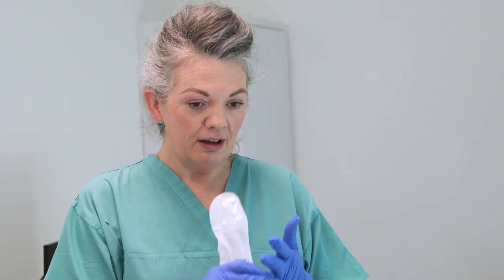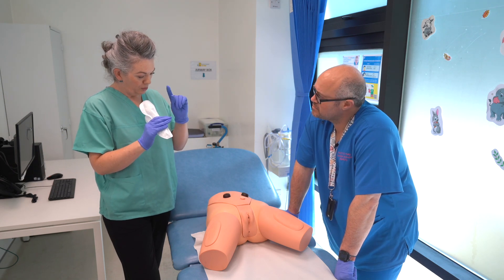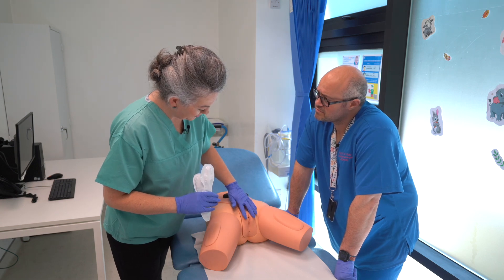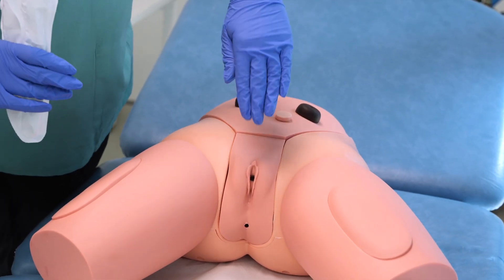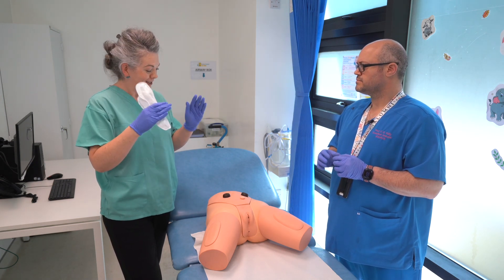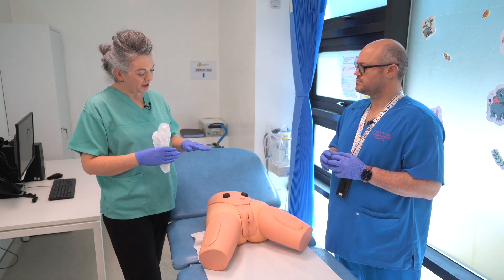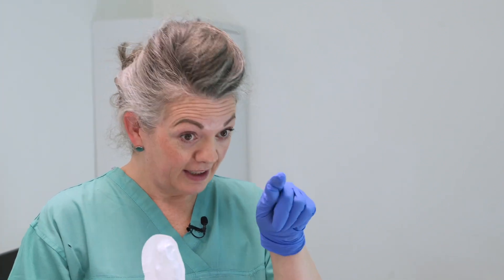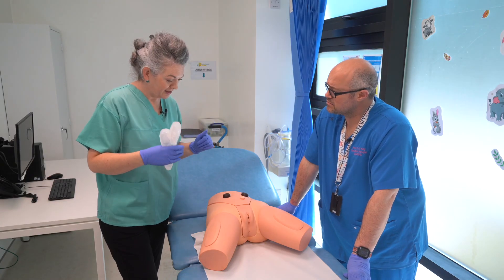The other obvious difference is female anatomy — you've got the urethral opening and the vaginal opening, which makes it slightly more difficult than catheterizing a male where there's one opening. In a female it can be harder to identify the urethra among the labia. A tip: if you get them to cough or bear down, the urethra will often open slightly, or they may pass a little urine, and you can see exactly where you need to go.